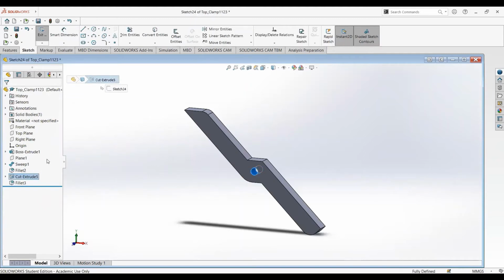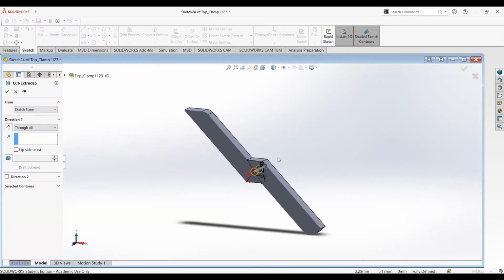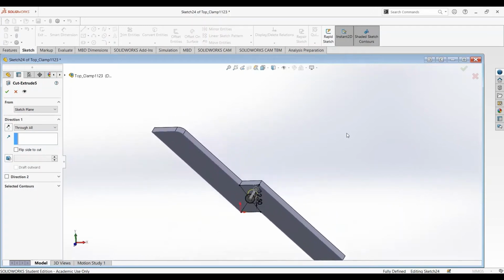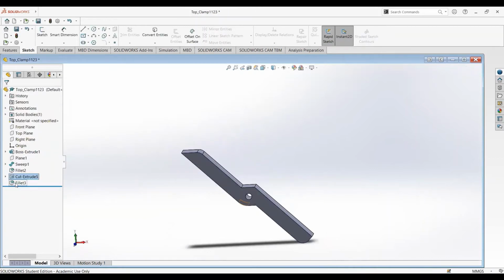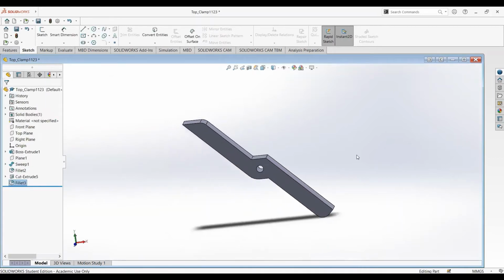Lastly, we created a circle right here, and then we're going to cut extrude, because we need to put a pin through this so the clamp can fit in the device nicely. This is what we did. We cut extrude. Lastly, we fillet this part so there's no sharp edges. So yeah, this is what we did for the top clamp.